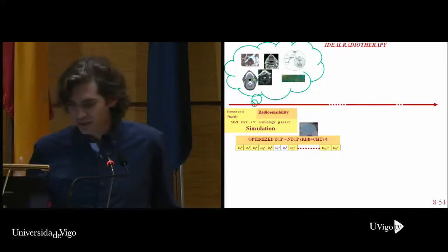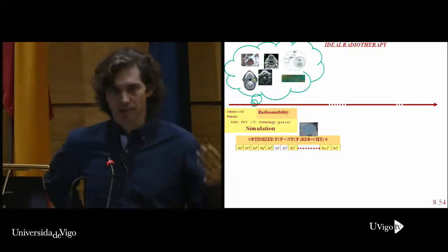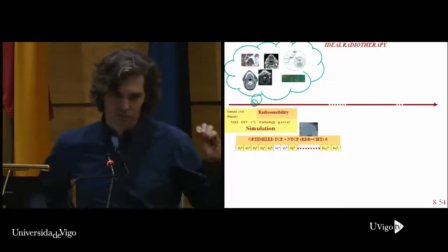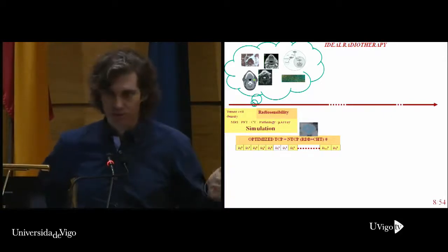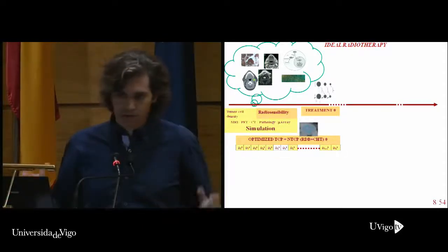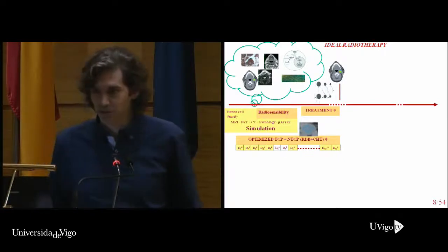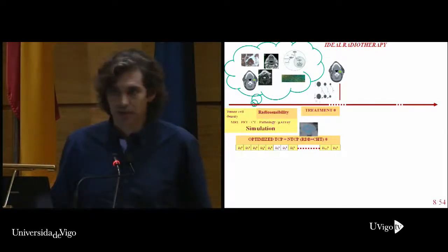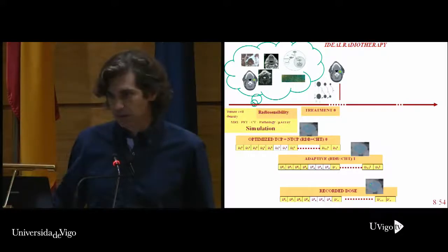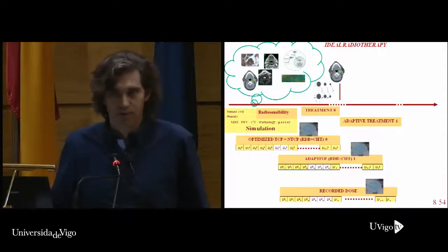After that, we can customize the treatment, and we don't need to deliver the same dose all the days to all the voxels. We can vary the dose for each voxel every day, considering reoxygenation and tumor shrinking. And we start the treatment, and the shrinking process starts, and reoxygenation, revascularization, all the dynamics we would like to know. And we can control the patient again in the first days of the treatment, and we can adapt the treatment to the individual response. And we can adapt one, two, three times.